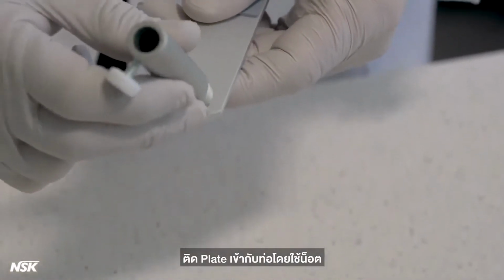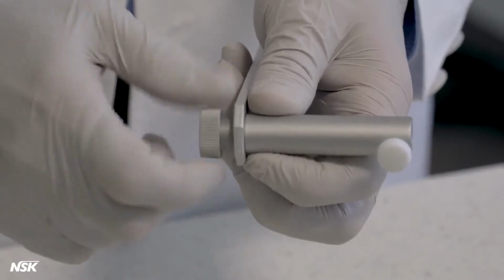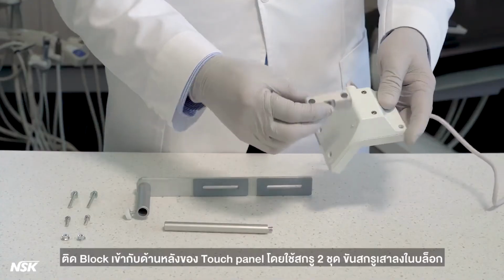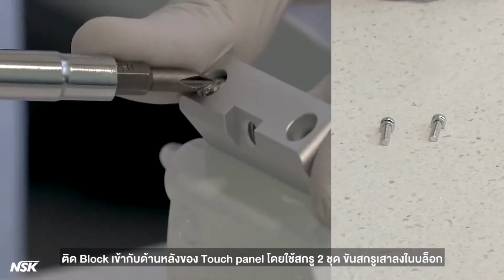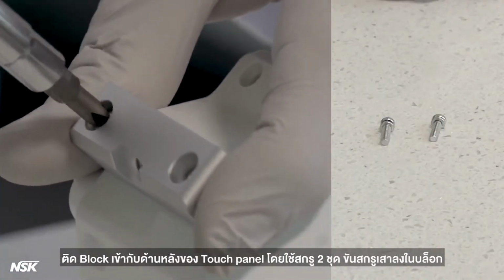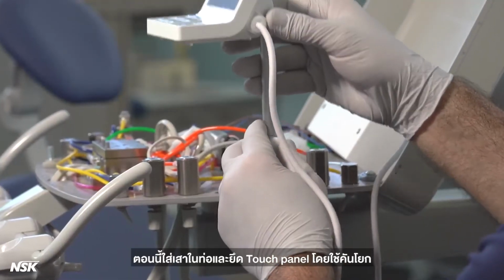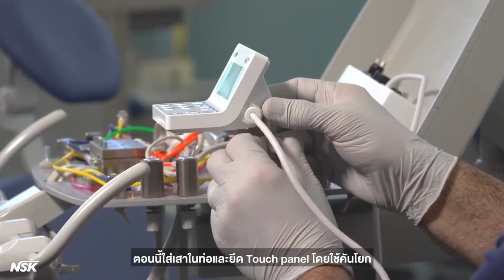Attach the plate to the pipe using the nut. Use the longer screws to secure the plate under the tray. Attach the block to the back of the touch panel using 2 set screws. Screw in the post into the block. Now, insert the post in the pipe and fix the touch panel using the lever.